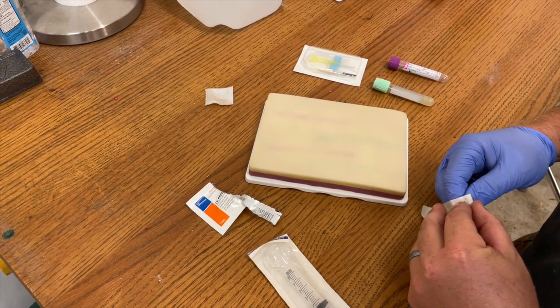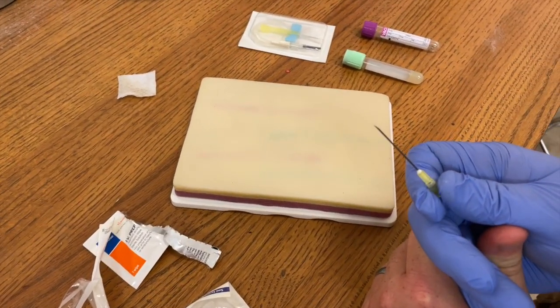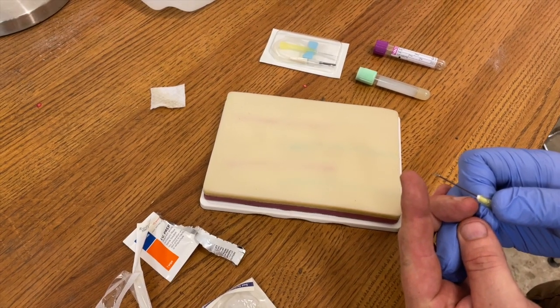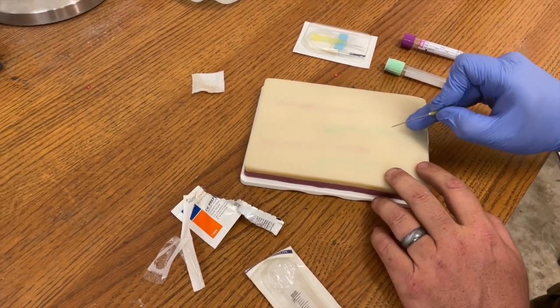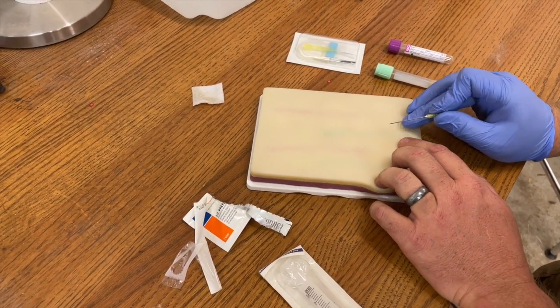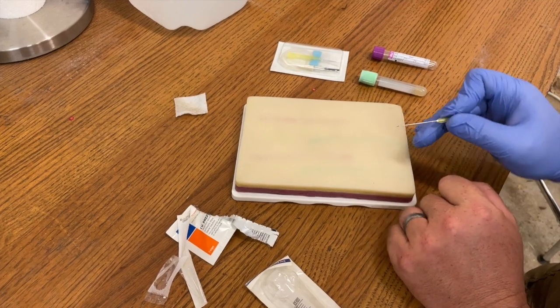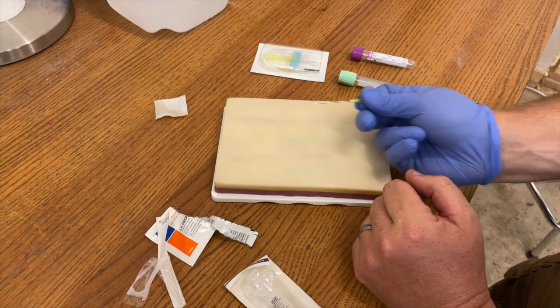One thing I want you to pay very close attention to is your needle and the bevel of your needle. If you look very closely at the tip of this needle, you'll see that it is angled — we have a slight downward angle on this needle. We always want that angle pointing down; that is, the bevel pointing up. The sharpest point is at the tip down there. When we access the vein, we're going to hold the skin taut and go in at less than a 45-degree angle, maybe 20 to 25 degrees. As we perforate that vein, you'll feel a little bit of a pop, and at that point you're going to rock back so the bevel slides across the top of that vein. If you go in upside down and rock back, that tip is going to get caught on the top of that vein and tear it up.